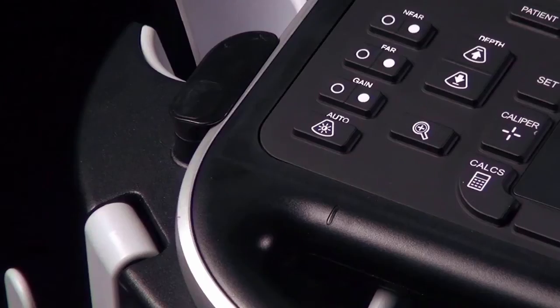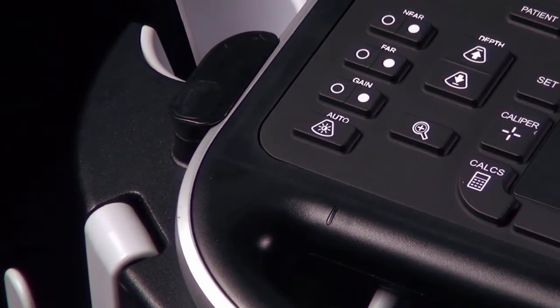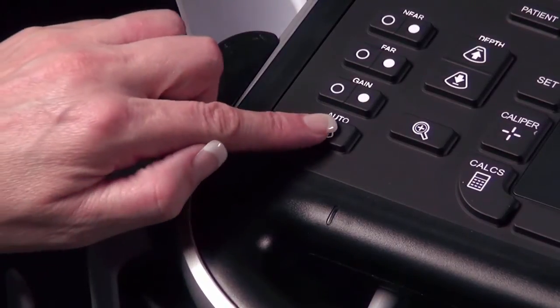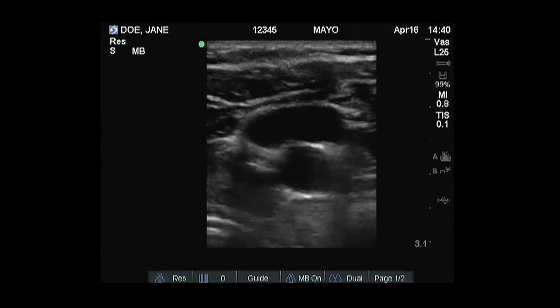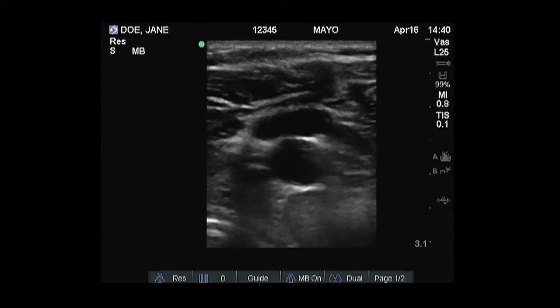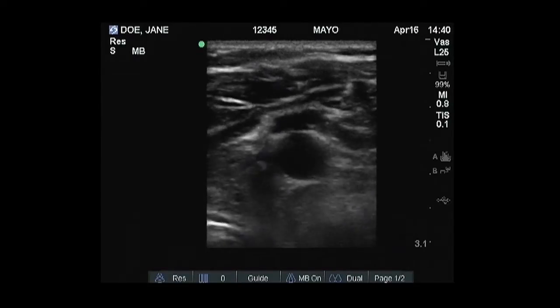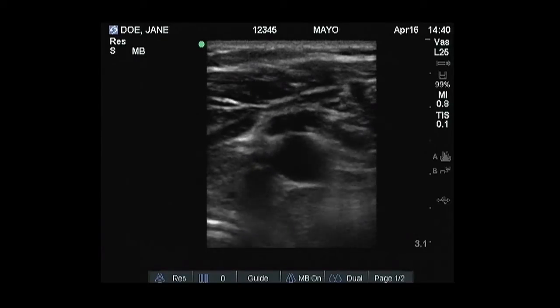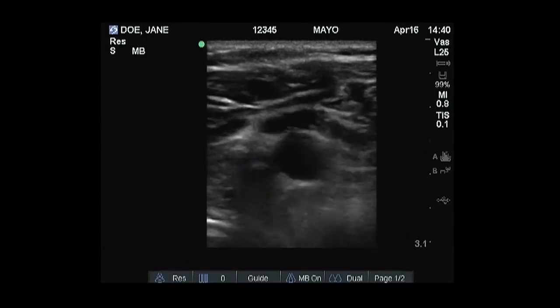For quick optimization of the gain settings on the system, press the Auto Gain key. The system will evaluate the image and apply the appropriate gain level settings to the image.